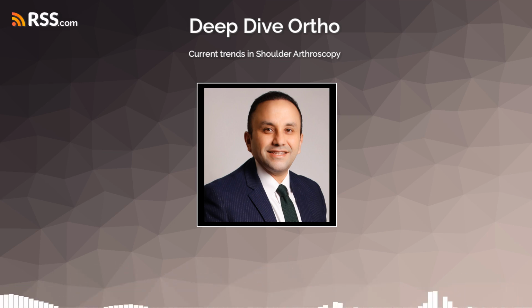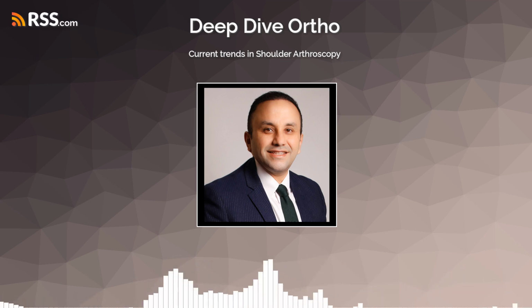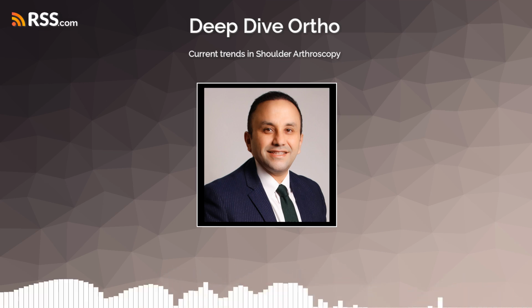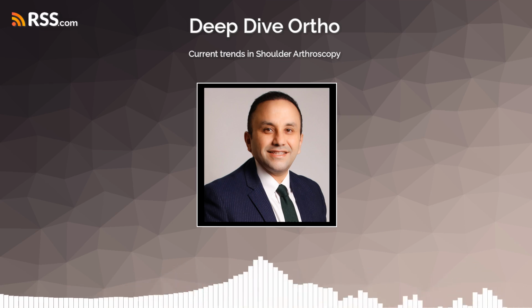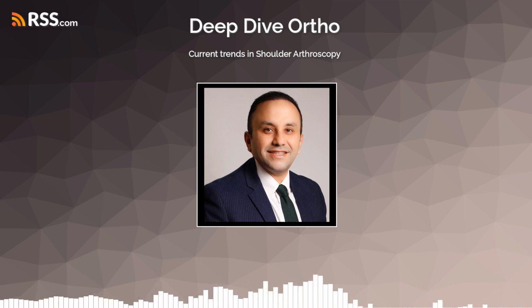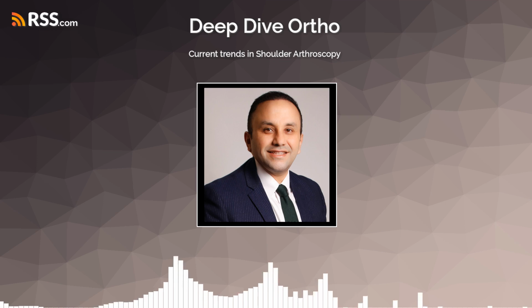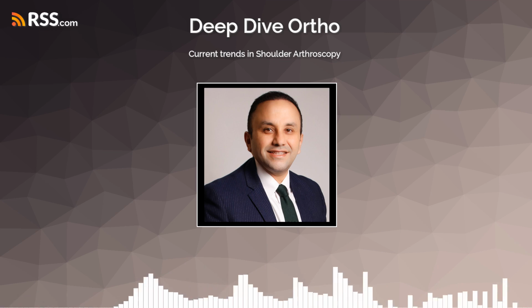They can. Complications like the bone not healing properly, non-union, the bone graft being reabsorbed by the body over time, or problems with the screws or other hardware used to hold the bone in place can occur. So, alternatives? Well, the arthroscopic J-bone grafting technique offers another approach. This involves taking a bone graft from the iliac crest, shaping it carefully to fit the glenoid defect, and then securing it arthroscopically. What's the advantage there? A key advantage is that it's arguably more anatomical, aiming to restore the natural shape of the glenoid. Plus, it doesn't leave behind permanent metal implants like screws.